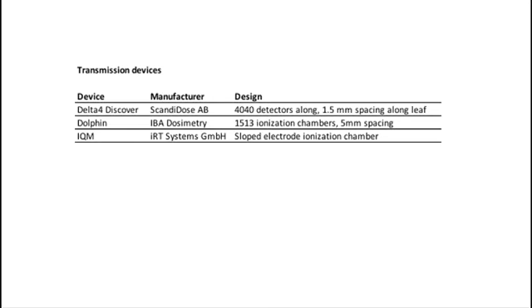One of the things that you worry about when you put anything in the beam before the patient is how does it affect the skin dose, the superficial skin sparing that should happen. But that's been measured with these devices, and it's thought to be relatively small.